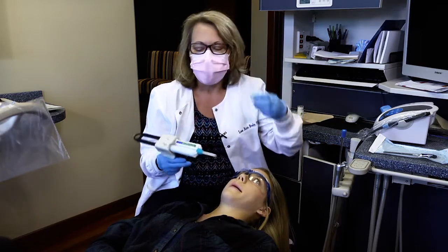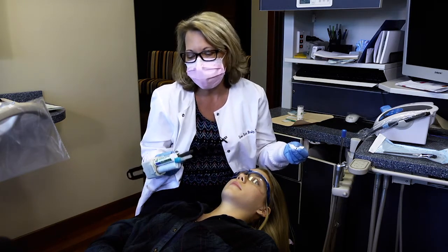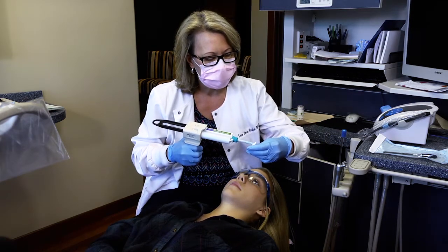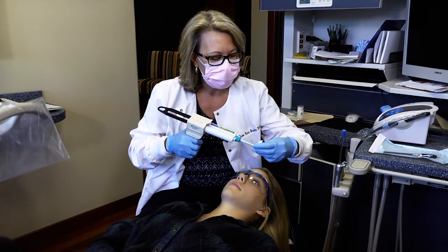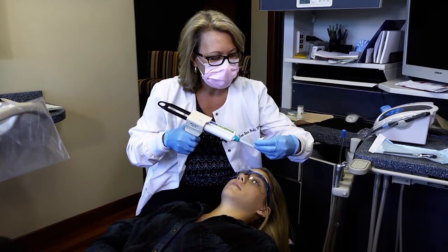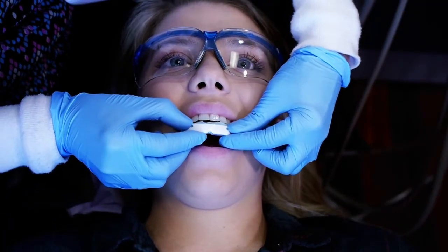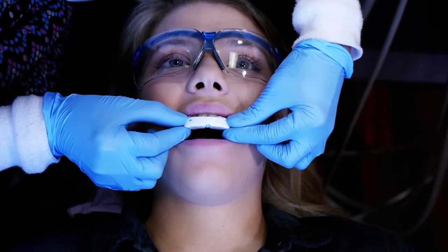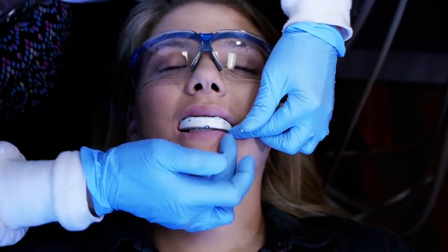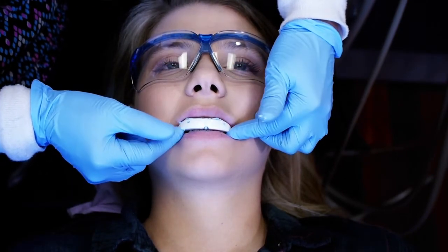Quick splints can be relined with bite registration material or other types of silicone putty. Today we're using the bite registration material. I'm going to fill the quick splint shell with the bite registration material — I want it to go right up to the top of the white part of the quick splint, but not overfill it. I'm lining this up with the midline, positioning the anterior of the flange, and asking Jenna to gently close. I'm eyeballing to make sure I've got contact on both sides but her back teeth are not touching, and now we just hold it until the material sets.